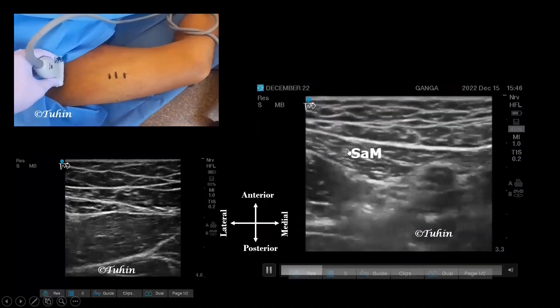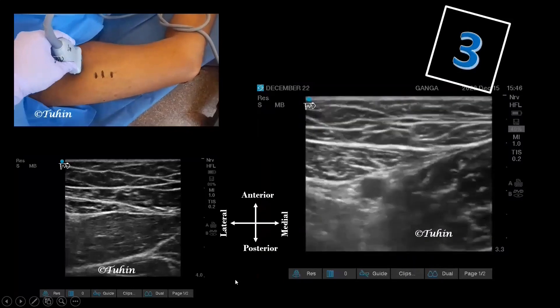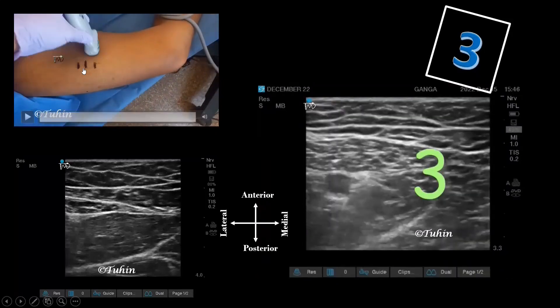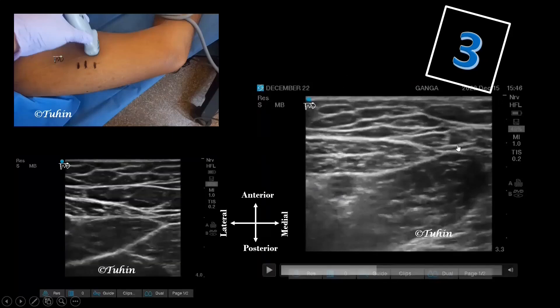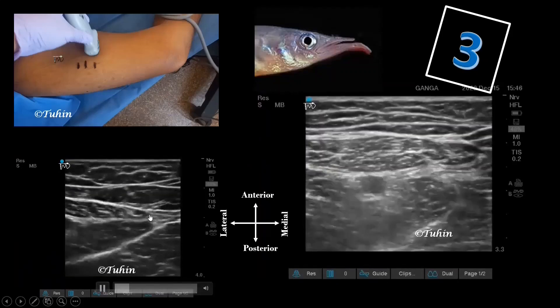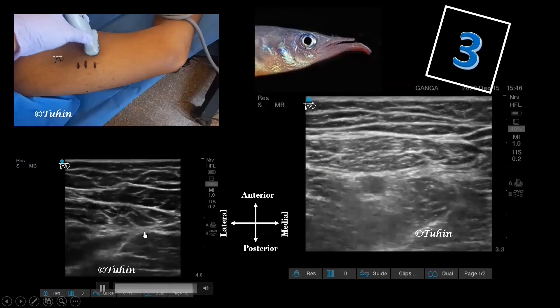By moving the ultrasound probe in the caudal direction, the apex of the femoral triangle can be identified where the medial border of the sartorius and the adductor longus muscle overlie, forming a figure of three. From this point, if we move the ultrasound probe one to two centimeters proximally, we will find the distal femoral triangle where the saphenous nerve lies just next to the femoral artery and the nerve to vastus medialis lies further laterally. This distal part of the femoral triangle — including the sartorius, adductor longus, and the femoral artery — appears like the head of a half-beak fish. For a quick recap: first find the sign of three, then proximally see the half-beak pattern, and distally see the shark head pattern.